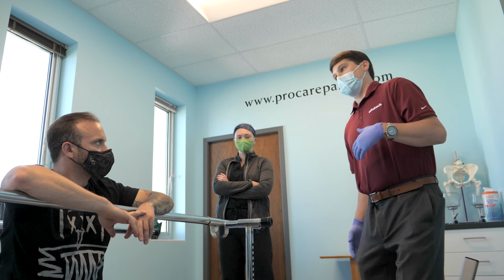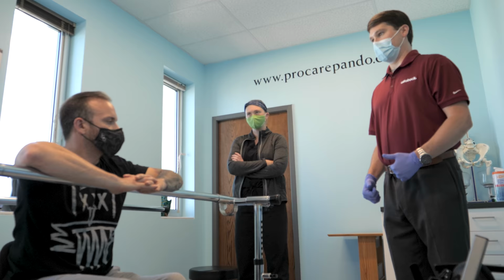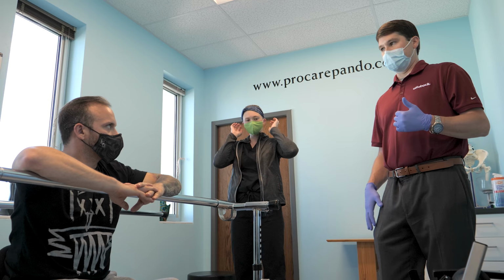A normal KAFO, knee, ankle, foot orthosis, works during stance. When you're in full stance, you're locked up, you're not going to go down. But if you're going downhill or downstairs where your knees are never really locked, there's nothing really keeping you up if you stumble. That joint can be wide open so you can fall. But the biggest thing to remember is it's not going to pull you up out of the chair, okay?